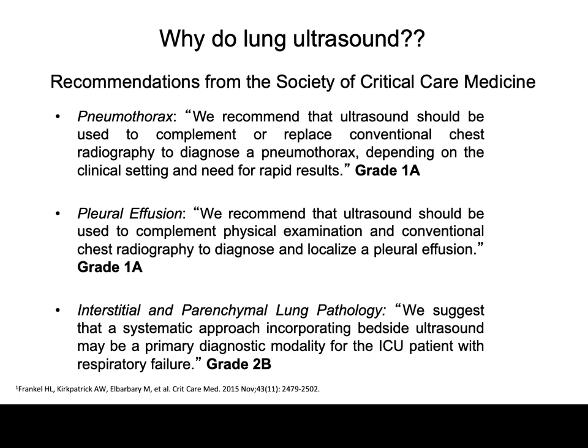For pleural effusion, they recommend that ultrasound should be used to complement physical examination and conventional chest radiography to diagnose and localize a pleural effusion. For interstitial and parenchymal lung pathology, they suggest that a systematic approach incorporating bedside ultrasound may be a primary diagnostic modality for the ICU patient with respiratory failure.